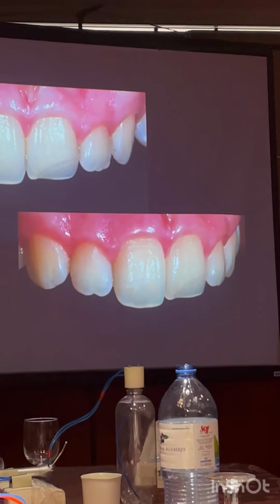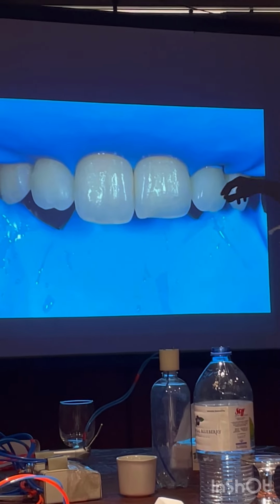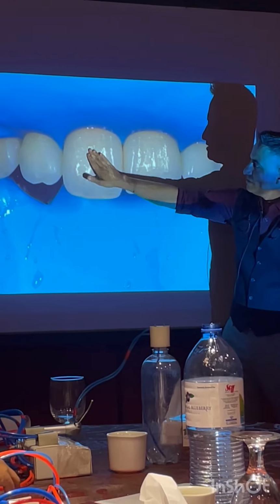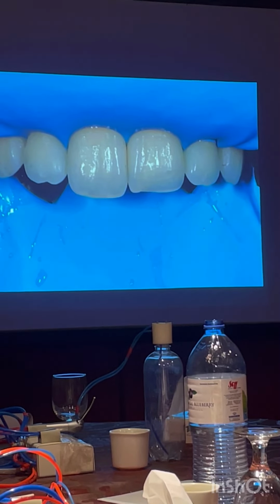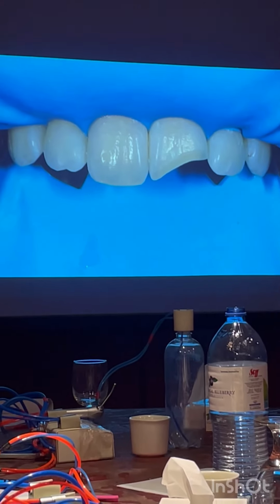So now what I do is I put rubber dam, and can you see the textures in this patient? Can you see the lobes running? See the depressions? Can you see all that? I have to mimic this. So what I do, I remove. It's a typical class 4.